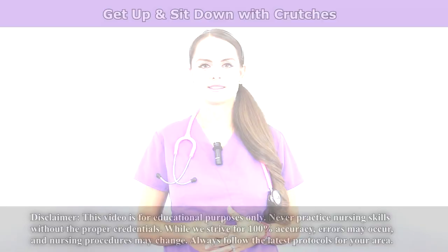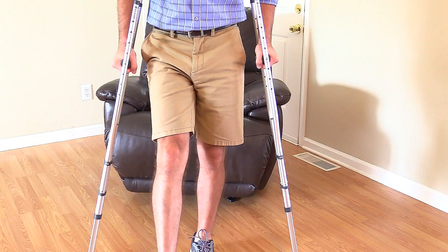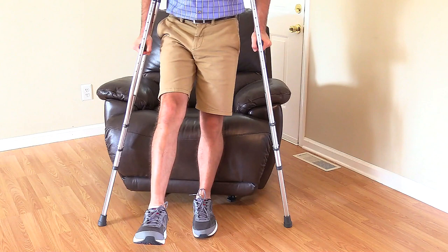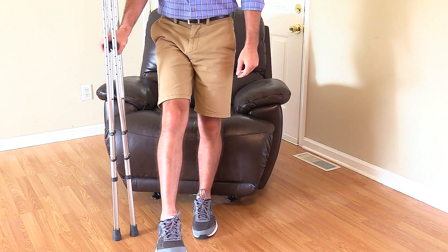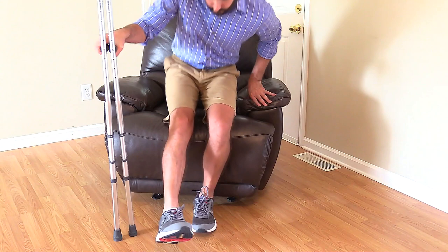To sit in the chair, the patient is going to back up to the chair and feel the chair with the non-injured leg. When the patient feels the chair with the non-injured leg, they're going to stop and move both crutches over to the injured side for support. Then the patient is going to grip the hand grips and slightly bend the non-injured leg and feel behind them, then sit in the chair while keeping the injured leg extended.